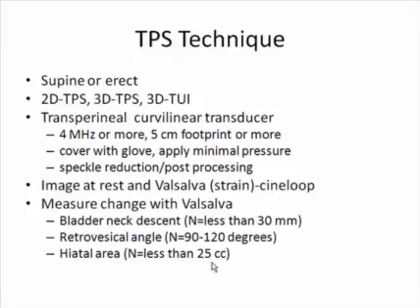However, we know that there are limitations with MR. I'd like to maybe talk a little bit more about the transperineal technique.